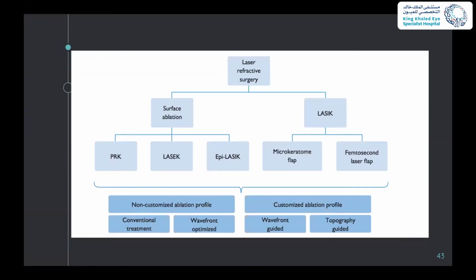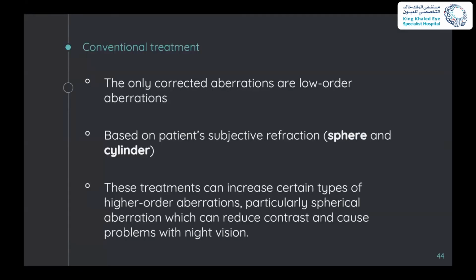And we're going to speak about them. The conventional way of treatment takes only the patient refraction, the sphere and the cylinder. And it can only correct a low order aberration. So it has nothing to do with high order aberration.